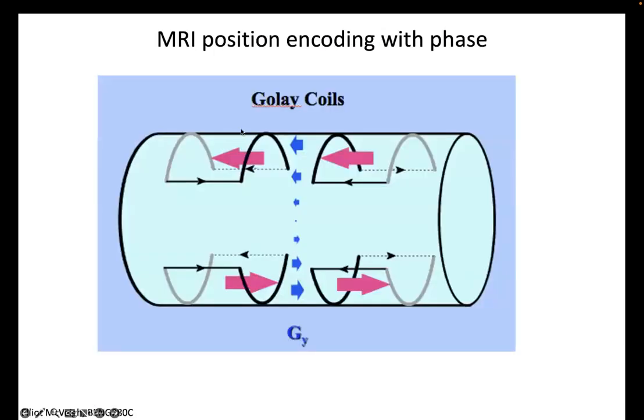So in order to create that change in magnetic field as a function of position, this is how these coils work. We pulse current in them, say in this direction, like along this arrow here. So my current is going around this element. There's 4 elements to this Y gradient coil. So this is the Y direction.